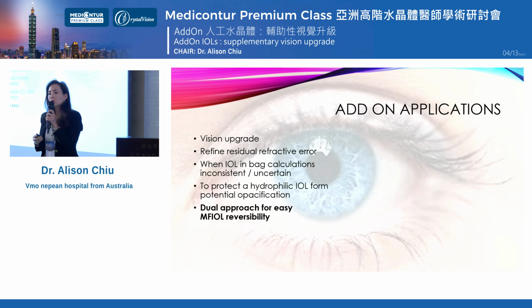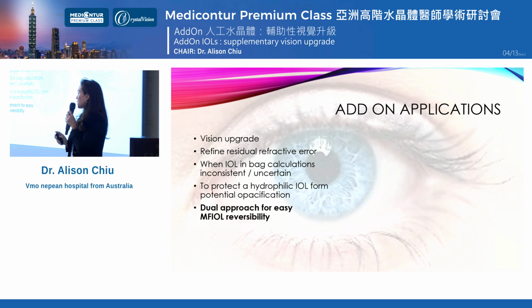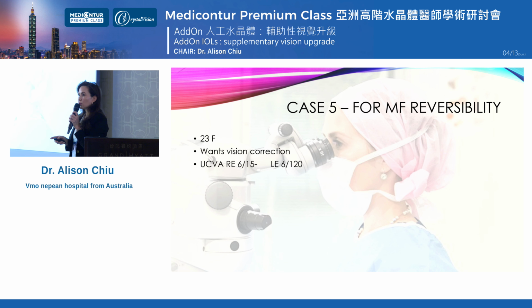So then let's talk about using 2 lenses at the time of the cataract surgery, which I spoke about a little bit earlier in this presentation. That's using a multifocal lens at the time of the cataract surgery to give reversibility to the multifocality for the patient who's not sure, or maybe has some borderline clinical measurements where you think, oh, is a multifocal the right thing for this patient?